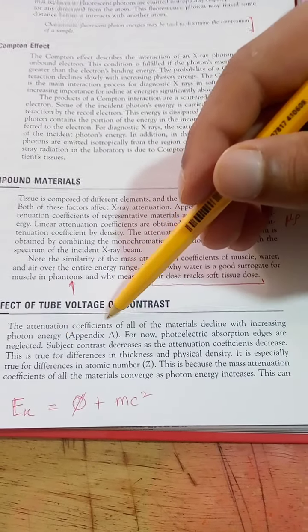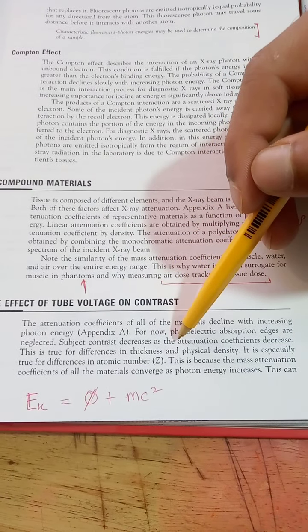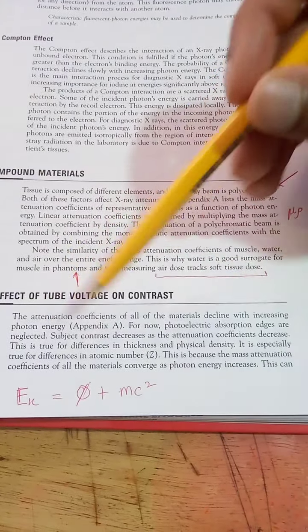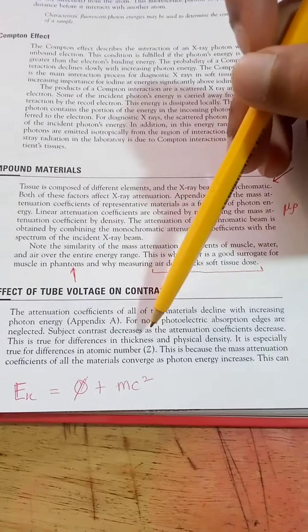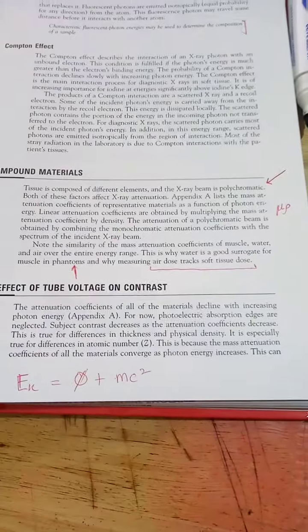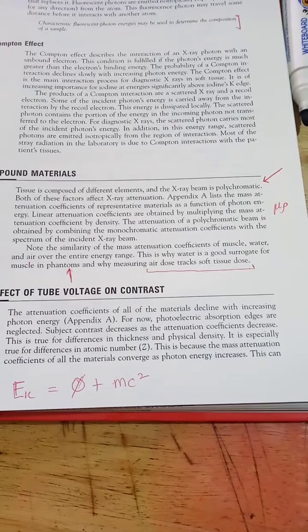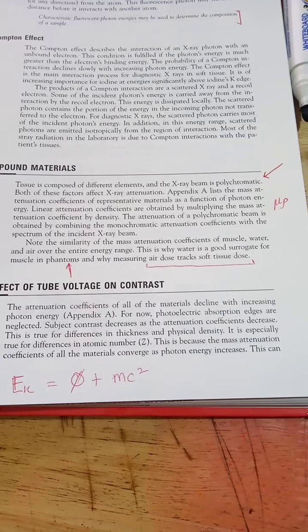So basically, attenuation decreases as the energy goes up. For now, photoelectric absorption edges are neglected. Subject contrast decreases as attenuation coefficients decrease. This is true for differences in thickness and physical density. It's especially true for differences in atomic number. This is because mass attenuation coefficients of all the materials converge as photon energy increases.